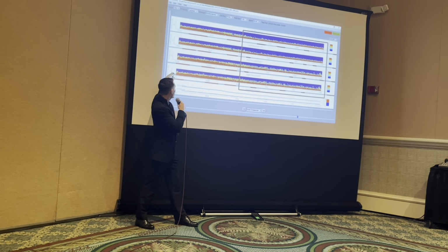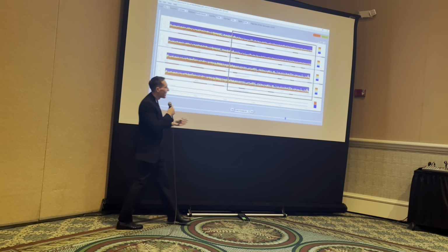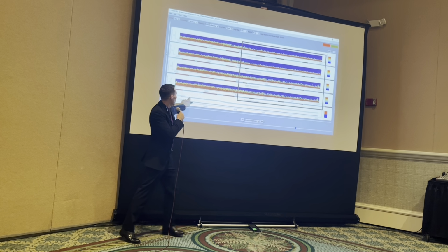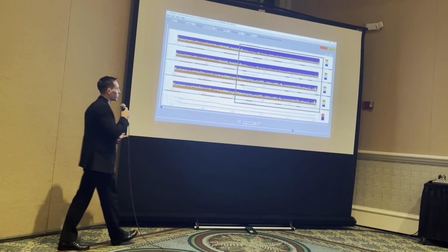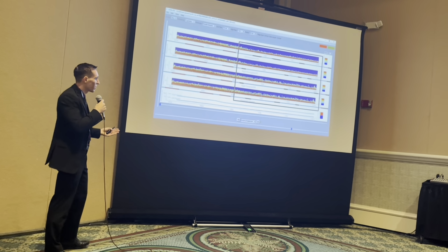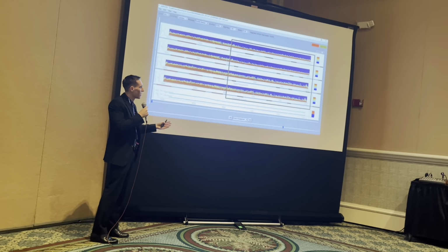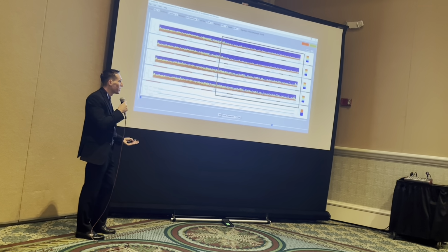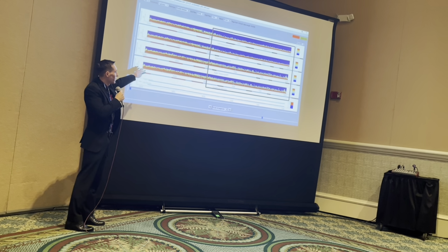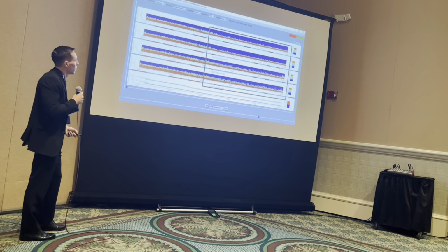So instead of the red being all the way up here, it simmered down a little bit, and the amplitude went down with it too. After the Ativan was administered, the patient was essentially left with their original background, which isn't great. It's showing slowing, but if this was the patient's background already and they're in the ICU, at least they weren't seizing anymore like they were over here.